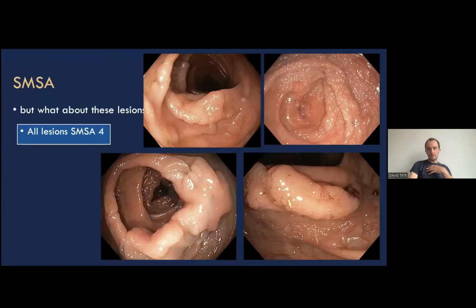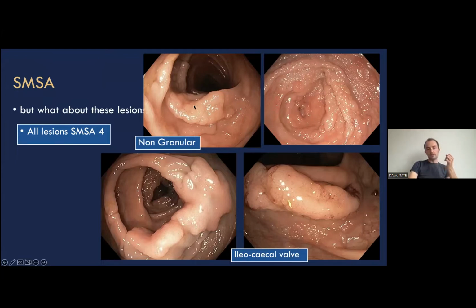Yeah. So the problem with SMSA is that there are some polyps which are very difficult to remove. They might all be SMSA4, the most difficult end, but they still nonetheless are even more difficult than that. So this one's non-granular. We talked about granular and non-granular. The difference between a granular polyp and a non-granular polyp is that a non-granular polyp, like this one, is often just shiny on the surface. So you see it from afar, it's shiny, and I will show you some examples of granular. In fact, there is one here where it's not so shiny and it's much more bobbly, like Rice Krispies in a bowl.